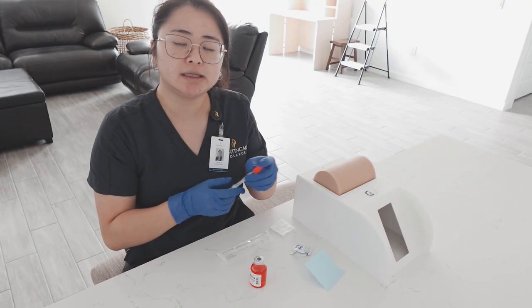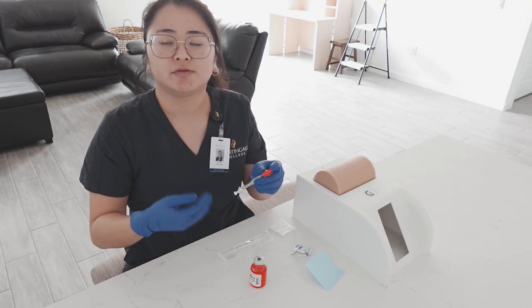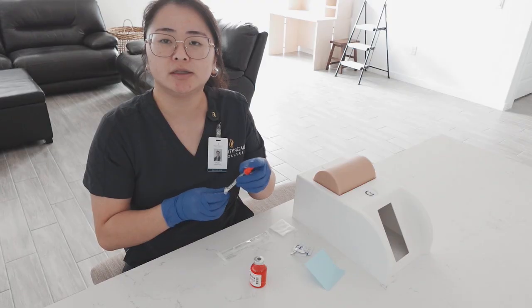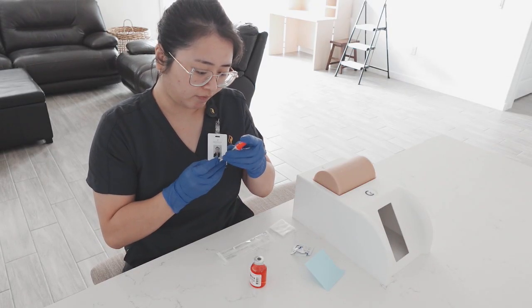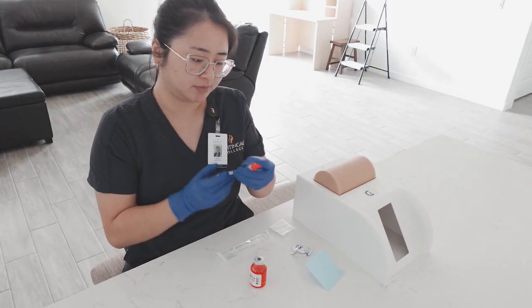As I said previously, our dose for this particular patient is 0.1 milliliters. So I'm going to inject air into the syringe, 0.1 milliliters.